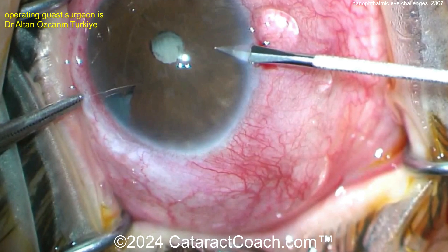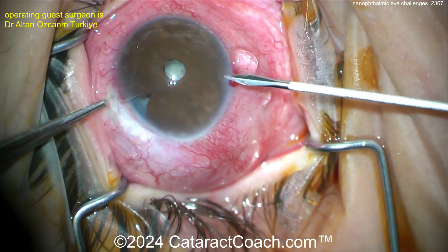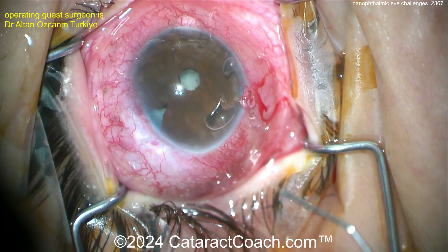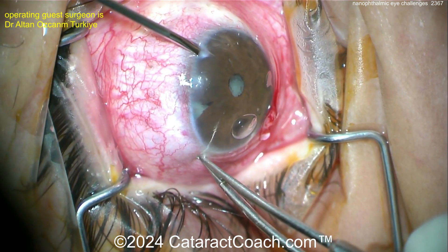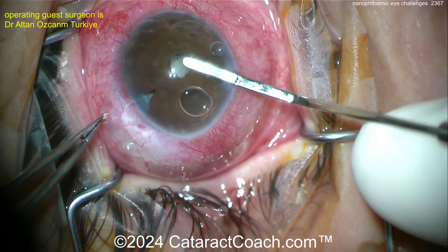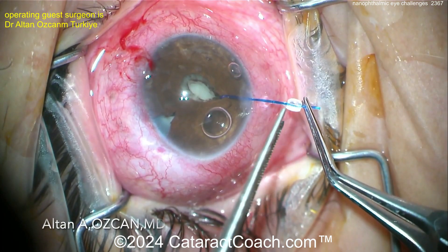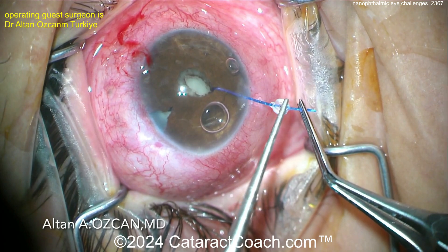Look at this case: a large surgical PI done in the past for angle closure, small pupil, dense cataract, shallow AC, and a 15-millimeter axial length. This is a very tough one. Putting just a little bit of viscoelastic in the eye, placing some paracentesis incisions for iris hooks, breaking the synechiae that's there, and getting these hooks in.